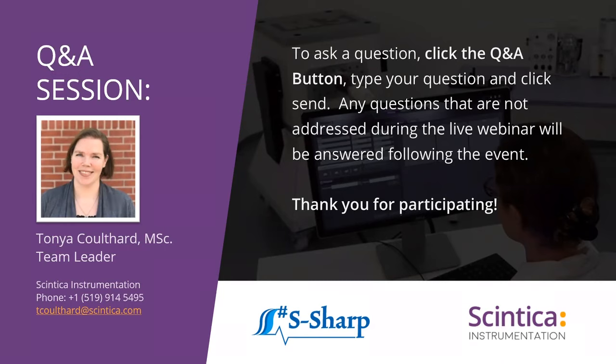I think the next question that we had that came through was about ECG and respiratory gating and if that was possible. On the animal handling platform that you saw both for mice and for rats, there's 4 electrodes, and those allow us to measure both the ECG as well as the respiratory signal. And both of those signals can be used to do gating on either, again, the respiratory or the ECG signal.